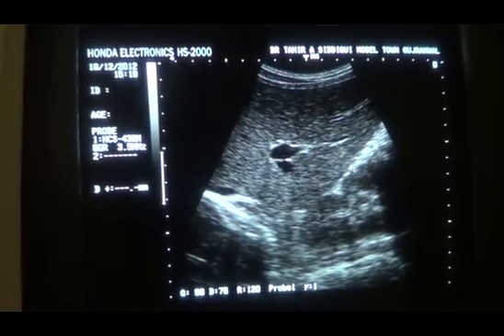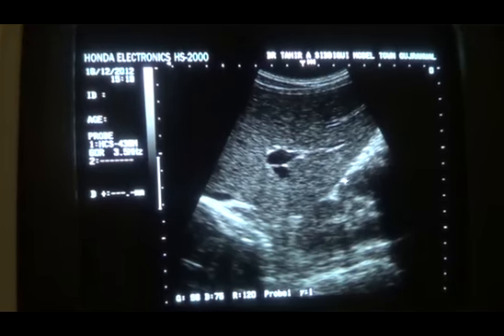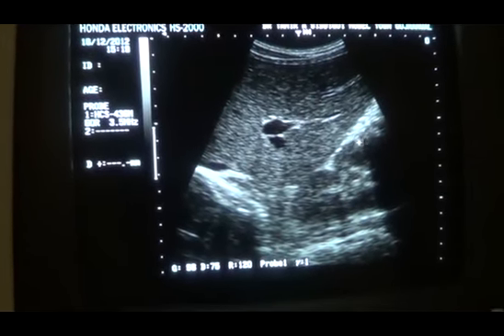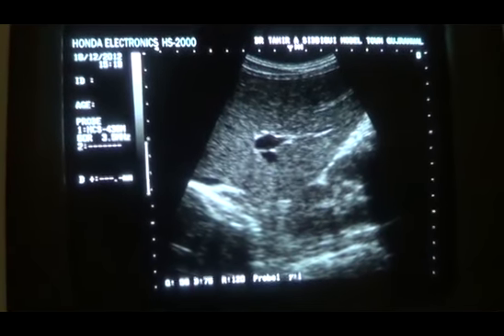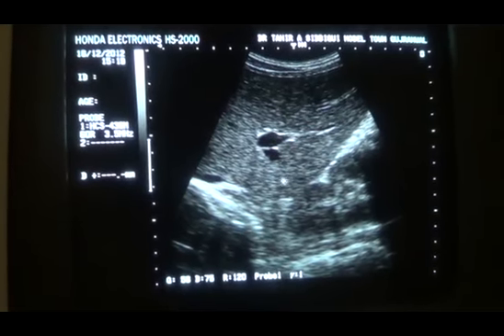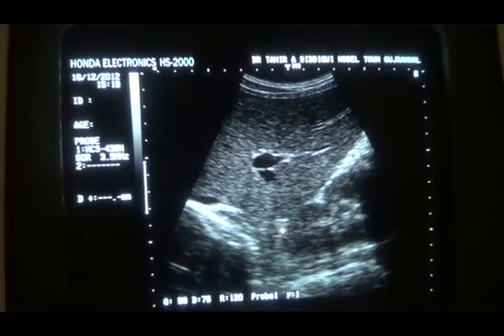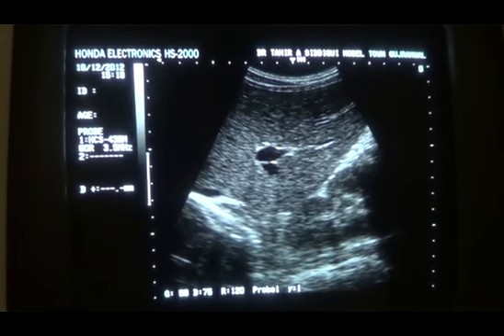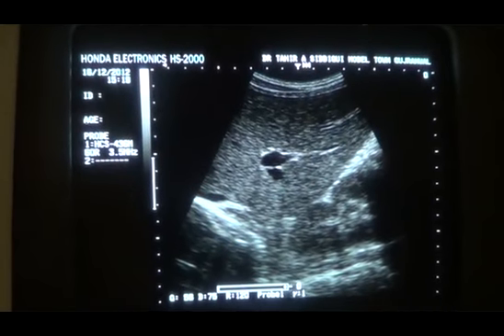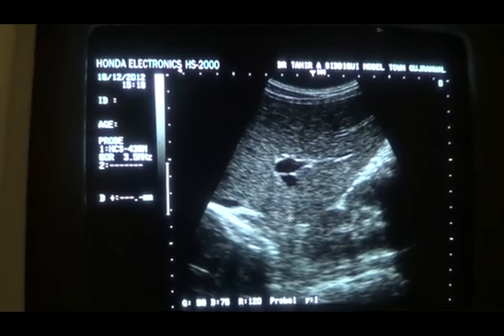In this case, the echogenicity of the liver is almost equal to that of the renal parenchyma, and this is considered to be normal. Now if you see that the liver parenchyma is slightly more or equal to that of the right kidney, then we will say that the liver has normal parenchymal echogenicity, no coarseness, homogeneous texture.